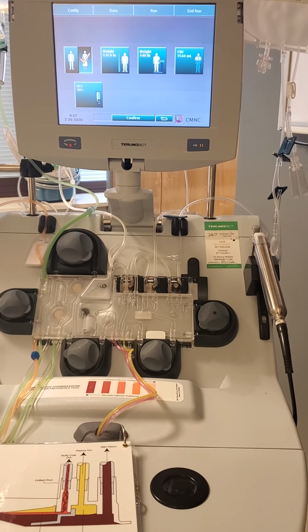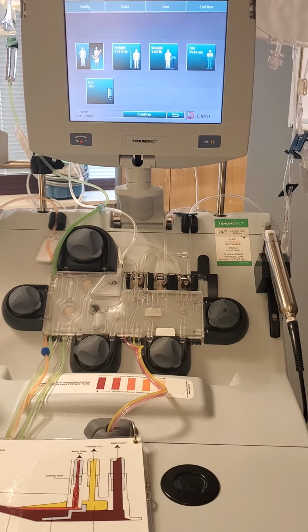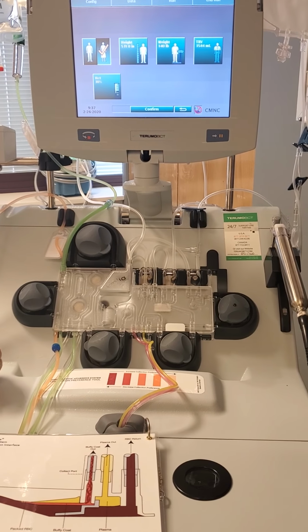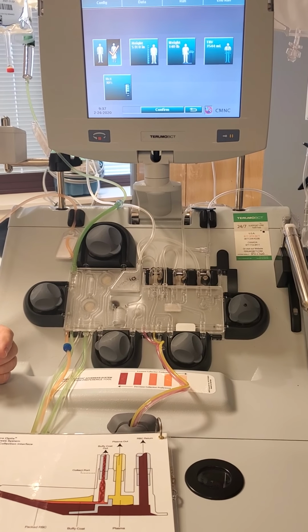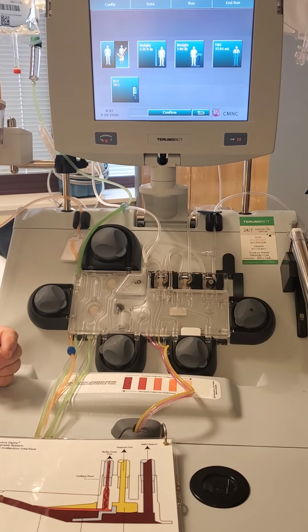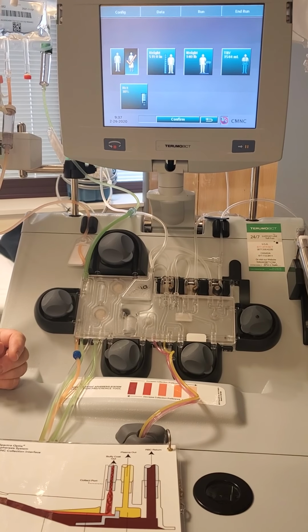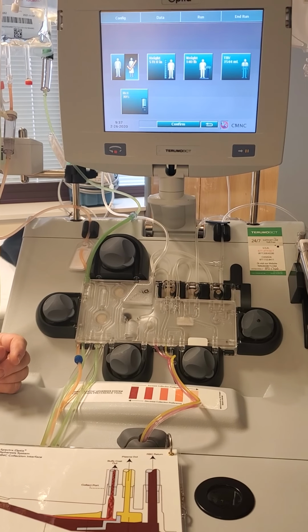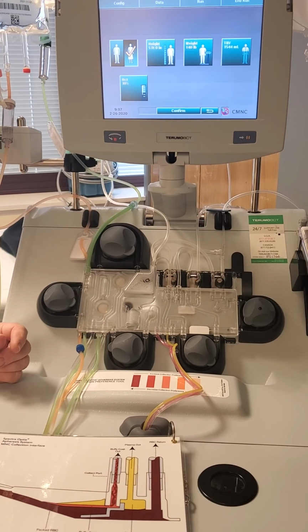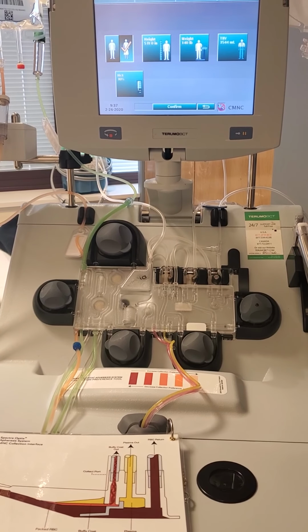Because the troubleshooting will be the reverse of spillover. Remember spillover? Red cells are spilling over into the plasma because the red cell layer is way too high. What did you do to correct that on Spectra? I just adjusted the hematocrit. Up or down? If it's spillover, that means high, so I'd lower my hematocrit. Other way. We raised the crit. By how many points? I think it was 3 points. 3. Same for Optia.